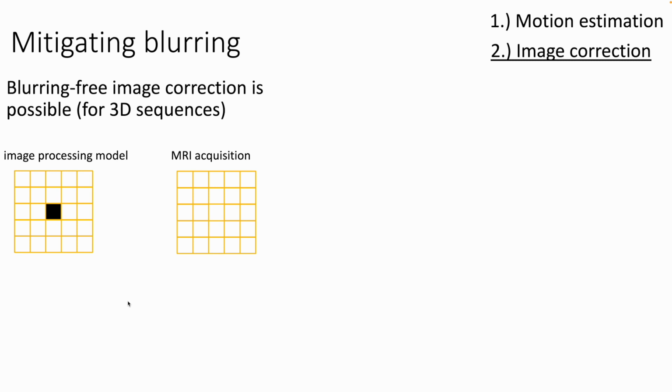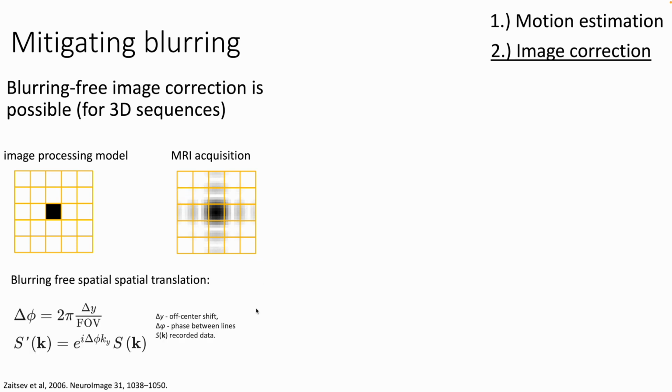Our voxel in fMRI rather looks like something like this, right? Due to the nature of the acquisition, we don't really have sharp edges to begin with. So based on Oliver Speck's equations that we probably saw in the first presentation, there is a mathematical formulation that achieves a completely blurring-free resampling.